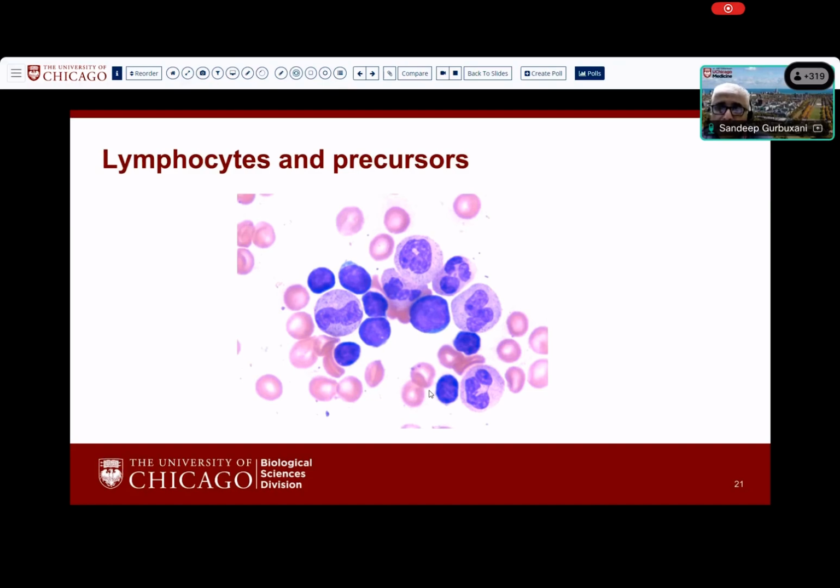The B-cell maturation happens in the bone marrow, and the precursors are present in the bone marrow. And in pediatric patients, particularly before the age of 1 year, they can be so abundant, they can be 40 to 50% of the bone marrow cellularity. And when the differential diagnosis for the patient is B-lymphoblastic leukemia, this can be very challenging. They do have a very distinct pattern of maturation on flow cytometry that I won't be going into today because you haven't had your flow cytometry lectures yet.